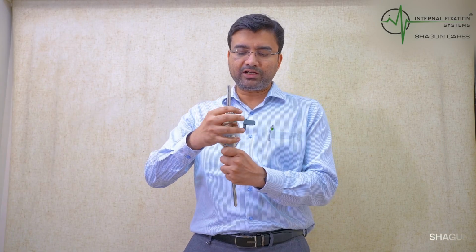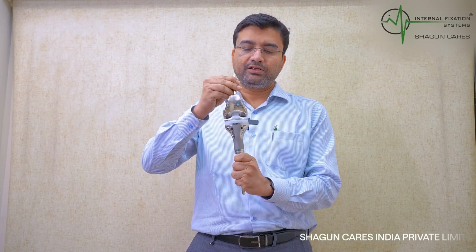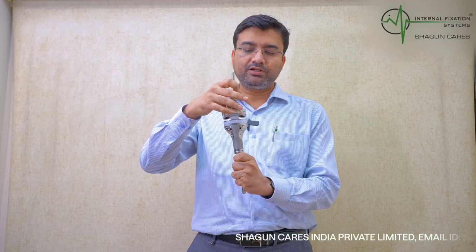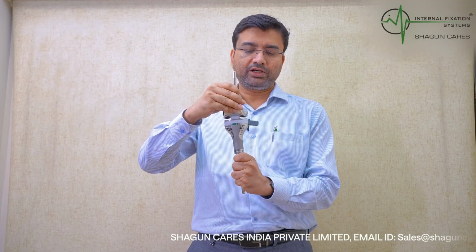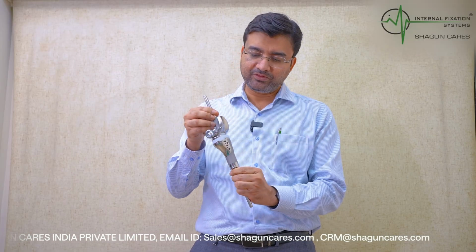Completes your locking mechanism of tibia with the distal femur. This is a complete rotating system and inherently stable, a constrained knee prosthesis of the proximal tibia. So where do we use this system? This I am going to show you now.